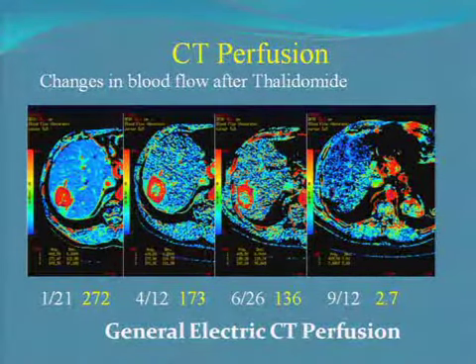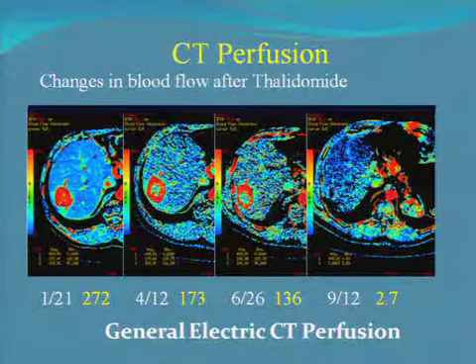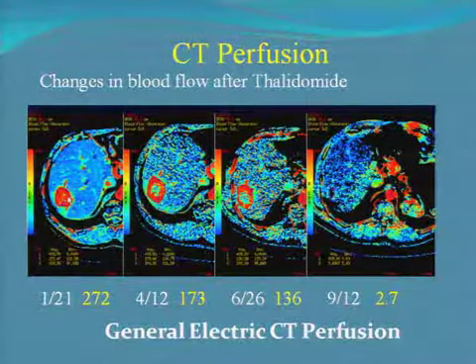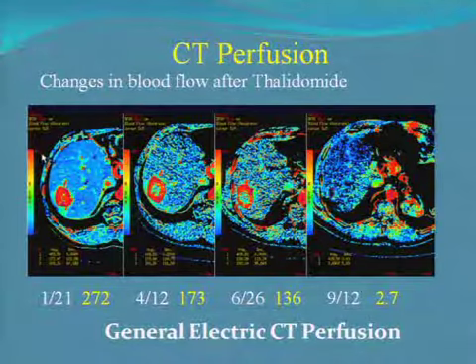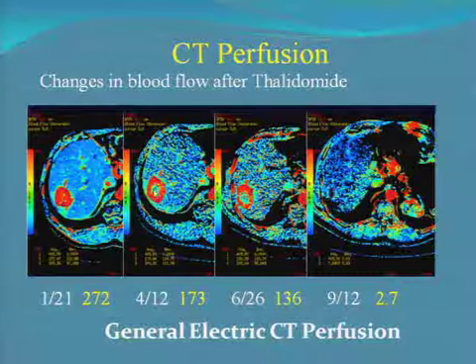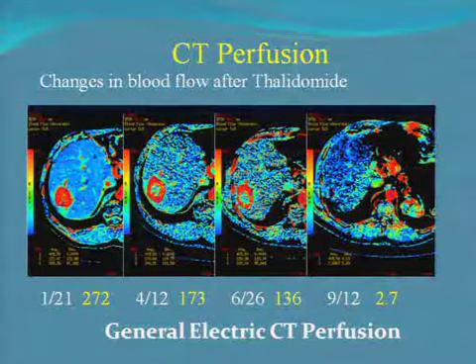So this is one of those few areas in radiology where having a color monitor is actually a requirement. This particular case was from my institution where we do this for tumors and not for stroke. But you can see over this 9 month period how the blood flow map changed in this particular liver tumor over time. It initially was very hot, meaning high blood flow, and that's what happens with growing tumors. They need to generate blood to grow and get their stuff going. Eventually, the treatment causes it to sort of cave in the middle. This is tumor necrosis. And after 9 months, metabolically, it looks the same as background. Now, structurally, it's probably still there, but from a functional standpoint, it has been killed, basically. So that's the idea with CT perfusion.